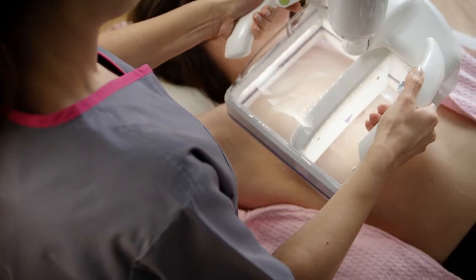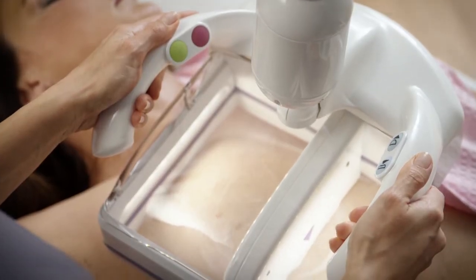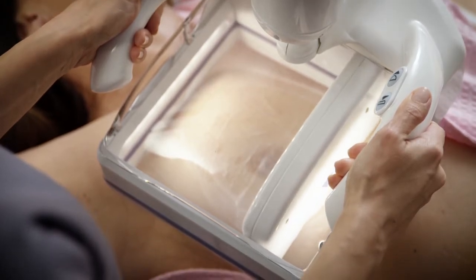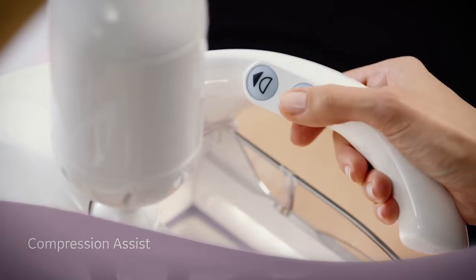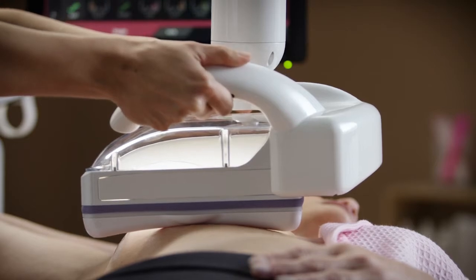The arrow on the transducer helps with alignment and positioning. Gentle pressure is applied to evenly thin the breast tissue while aligning it parallel to the skin. The compression assist feature is used to set the pressure to one of three levels. Compression levels are adjusted while the patient breathes normally.